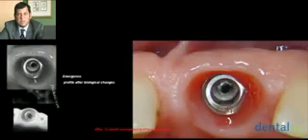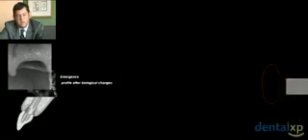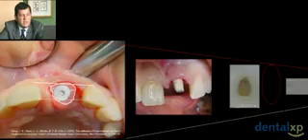The most important aspect is the buccal aspect, because in these cases we are trying to maintain the soft tissue margins and not have any buccal recession. Studies in the literature showed that we need a minimum of 2 mm of bone to avoid a future recession or resorption of the buccal plate. If this is not the case, we are trying to graft even if the space between the implant and the buccal plate is 1 or 1.5 mm, to avoid future recession.